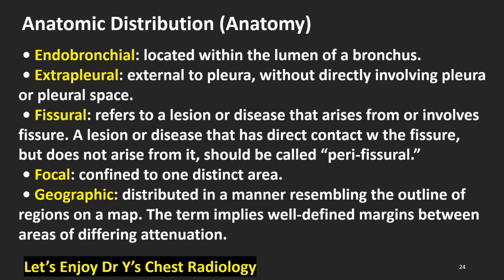Geographic: distributed in a manner resembling the outline of regions on a map. The term implies well-defined margins between areas of differing attenuation.